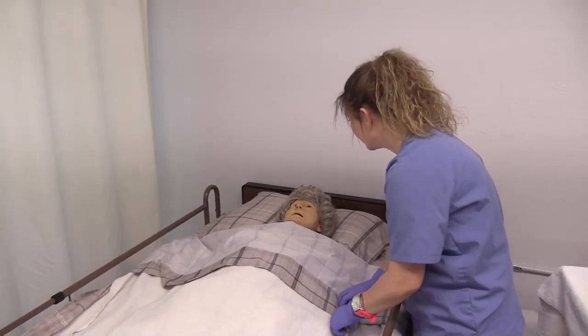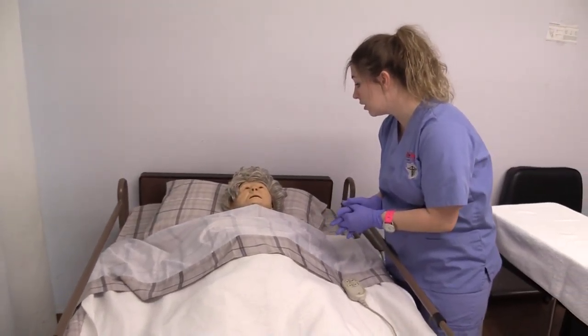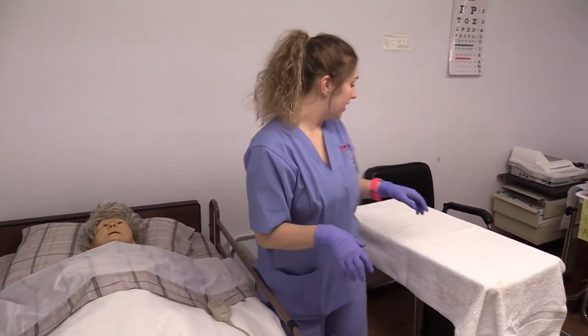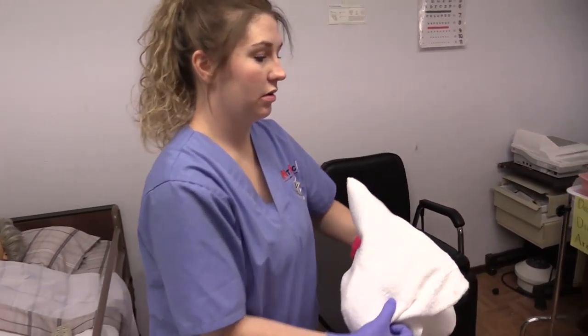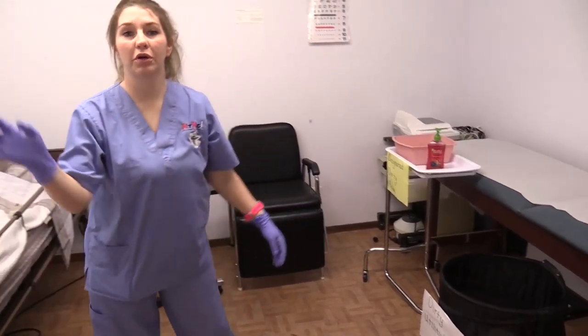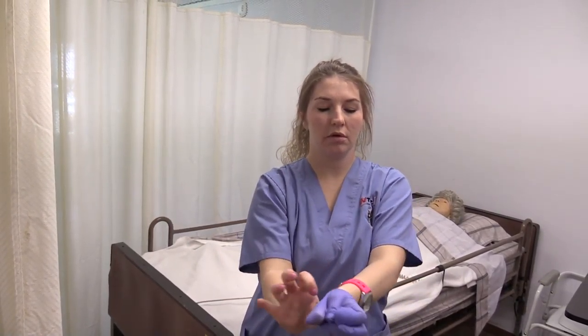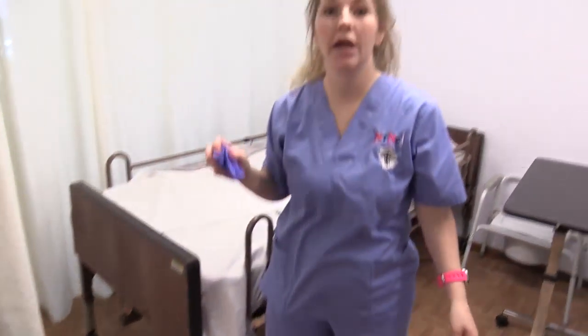Miss Jane, are you comfortable? Is there anything else I could do for you? Thank you very much for letting me do the catheter care. Take the barrier towel and place it in the dirty linen hamper. Remove the privacy curtain so the patient can have visibility. Remove your gloves without contaminating yourself. Again, make sure the bed wheels are still locked. Then go wash your hands and that will complete the skill.